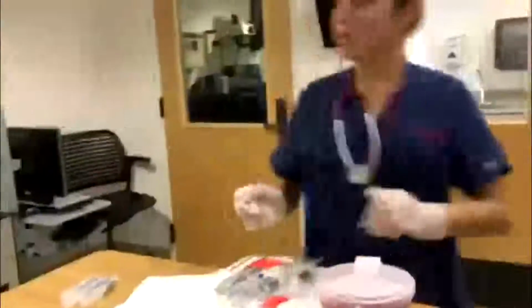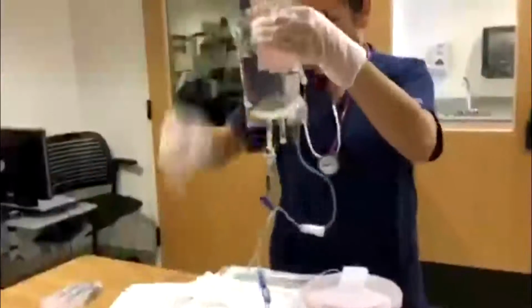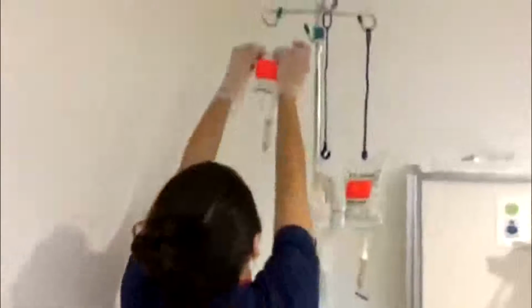So right now I'm just going to prime my solutions, making sure to maintain sterile technique. I want to make sure that my primary solution is hanging lower than my secondary solution. So my primary is sodium chloride, normal saline, and my secondary is the Zosyn, which is the antibiotic, which will be hanging higher.